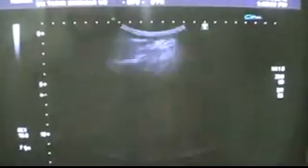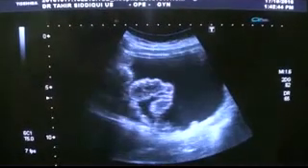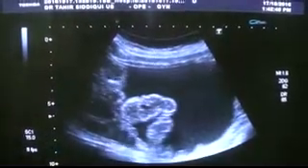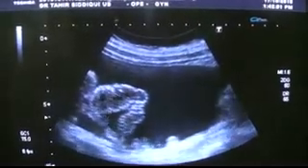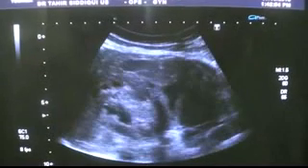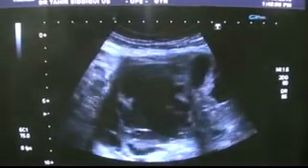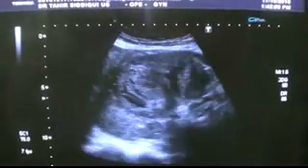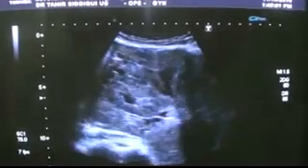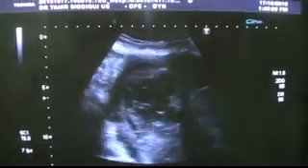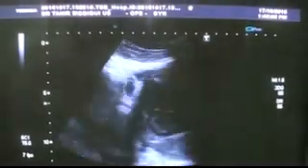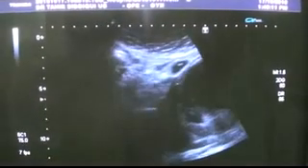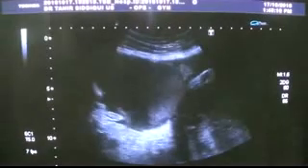This is fluid in the paracolic gutter — in the right and in the left paracolic gutter — with floating bowel segments within it. As I come down, the mass starts again. To summarize, this is a case of a pelvic mass extending on both sides up to the umbilicus in the midline, with expansion and extension into the right hypochondrium, with malignant ascites.